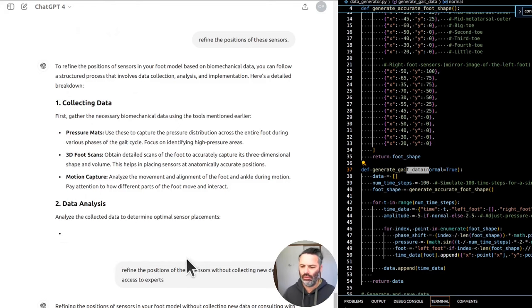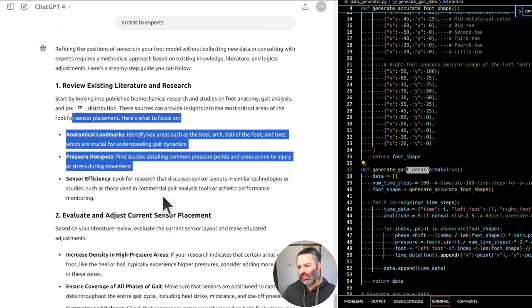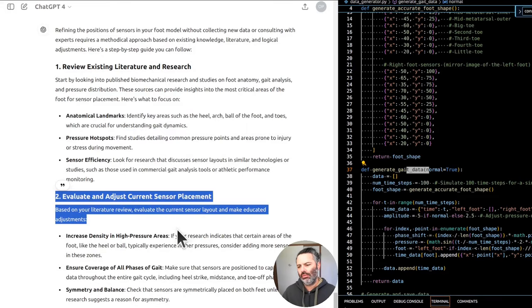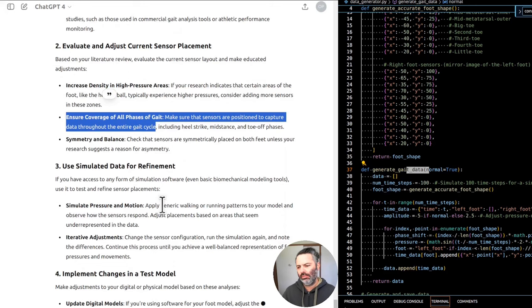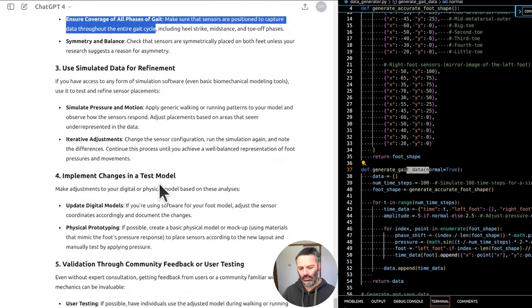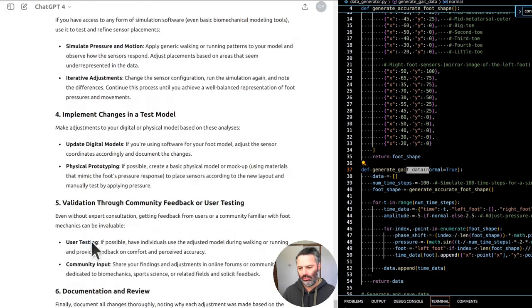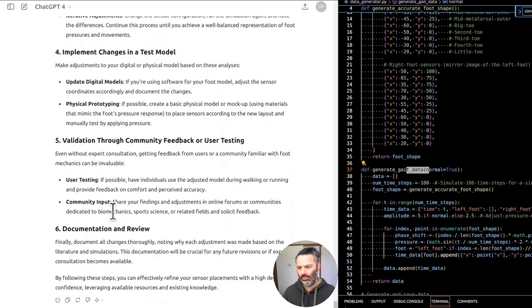However, further refinement and validation with real-world data would enhance it. To refine the positions of sensors in your foot model based on biomechanical data, you can follow a structured process that involves data collection, analysis, and implementation. Here's a detailed breakdown. 1. Collecting data. First, gather the necessary biomechanical data using the tools mentioned earlier. Pressure mats. Use these to capture the pressure distribution.